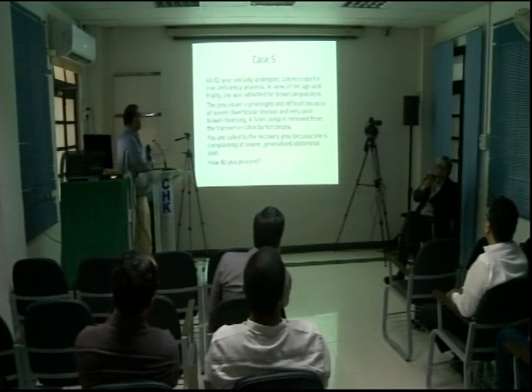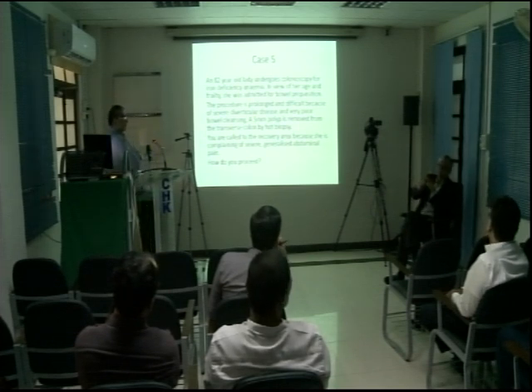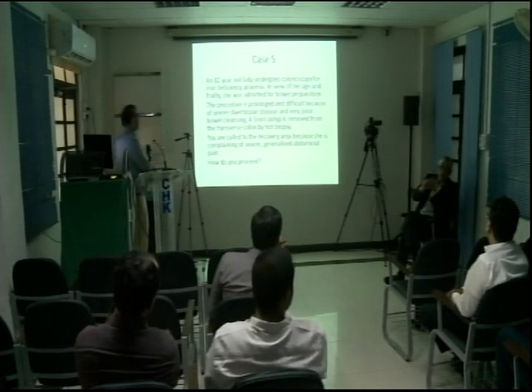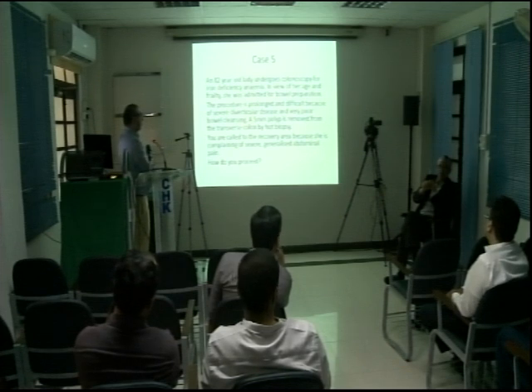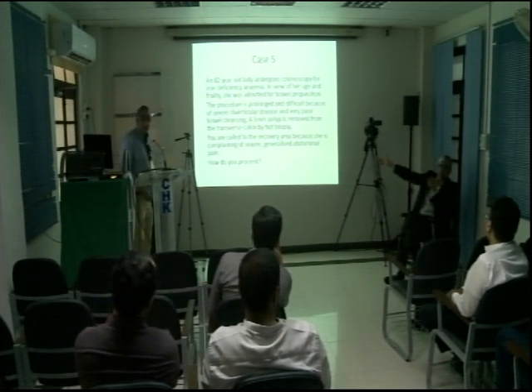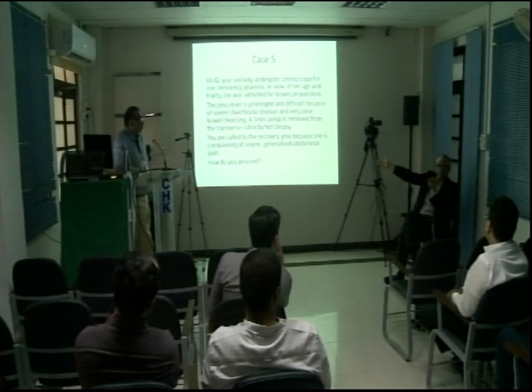So you've gone and done a colonoscopy with bad bowel prep in a bad diverticular disease. That's bad news. Second, a 5 mm polyp removed from the transverse colon. So you see, one after the other, all wrong. If you had to take it out, a 5 mm polyp, cold snare.